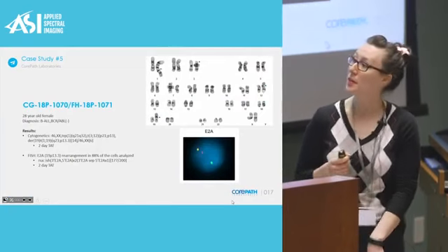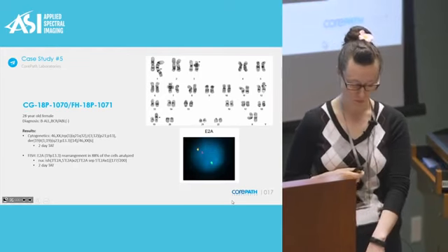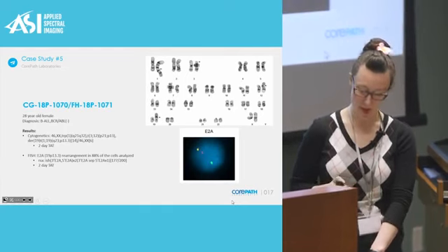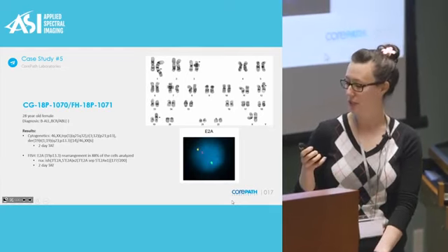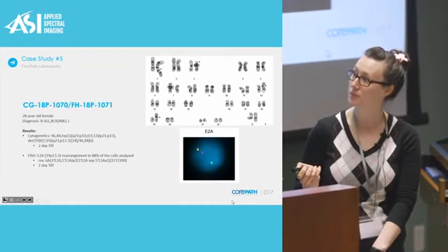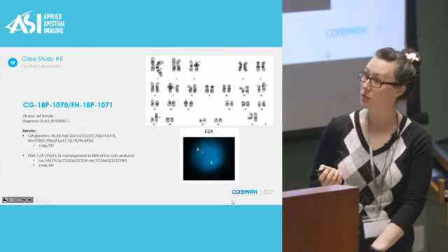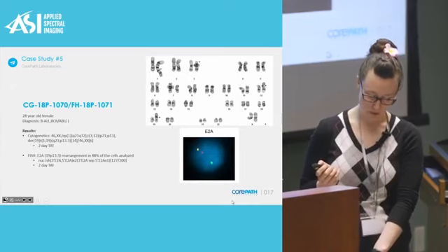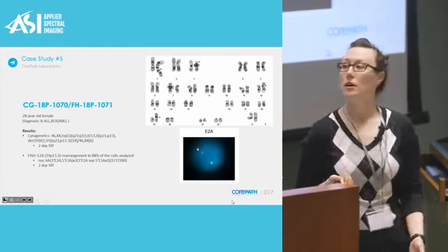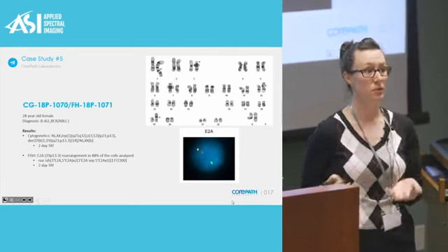We have a 28-year-old female presenting with B-ALL that is BCR-ABL negative. Within 2 days, cytogenetics and FISH both released their results, and there was an abnormal pattern for the E2A region by FISH. The E2A region lives on 19p. There was an abnormal E2A region in 88% of the nuclei analyzed. So again, we have a relationship between cytogenetics and FISH. Now, we do know that E2A is abnormal, specific question, specific answer.